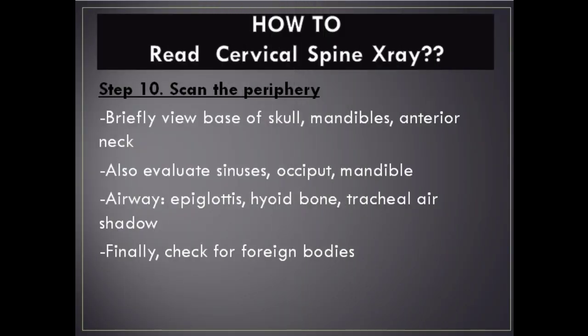Step 10 – Scan the Periphery: Briefly view the base of skull, mandibles, and anterior neck. Also evaluate the sinuses, occiput, mandible, airway, epiglottis, hyoid bone, and tracheal air shadow. Finally, check for foreign bodies.